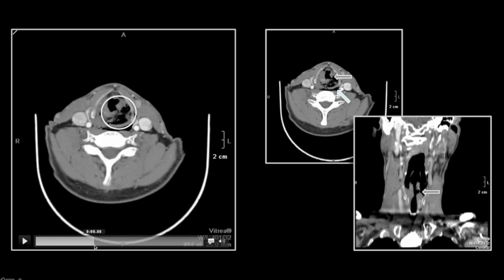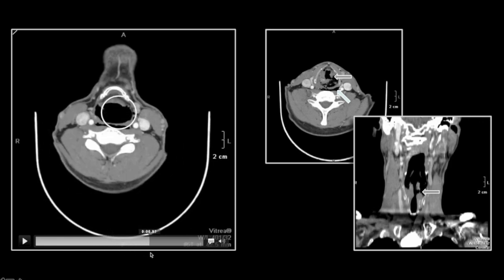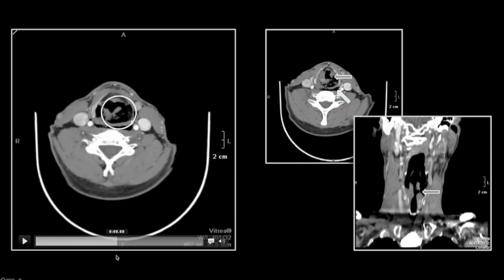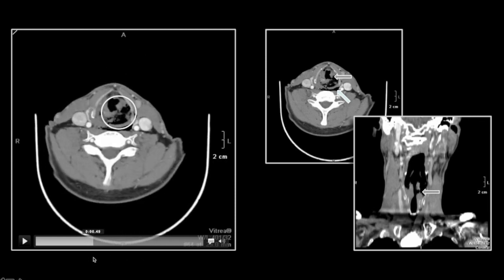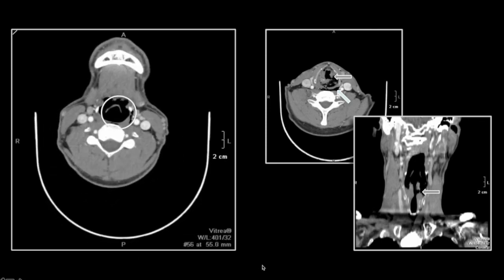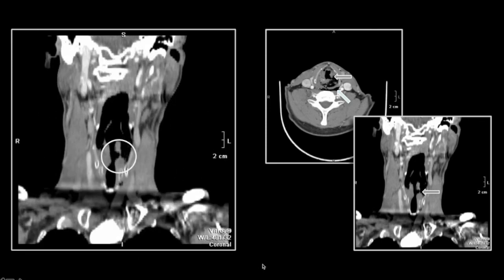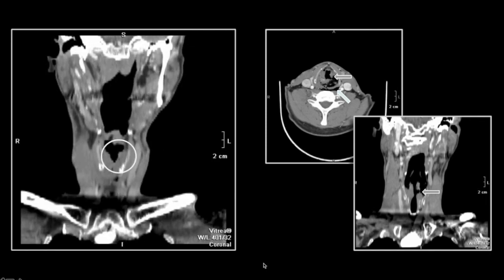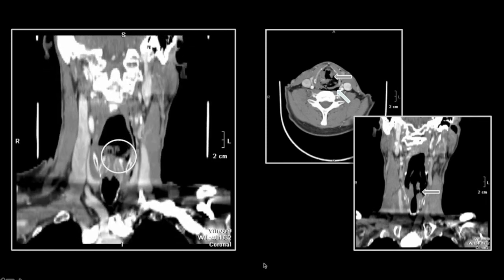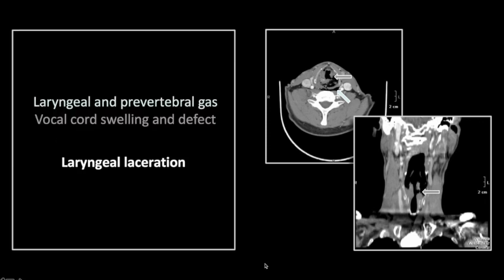There is that defect, allowing the gas to exit. And here it is on the coronal. So that was a laryngeal laceration. This was an assault and an attempted choking, and the pressure of that attempted strangulation is what caused this defect.